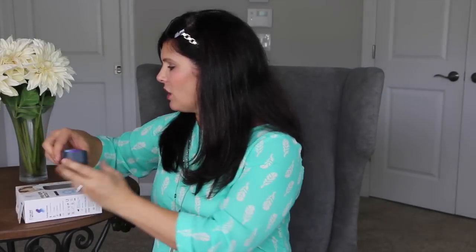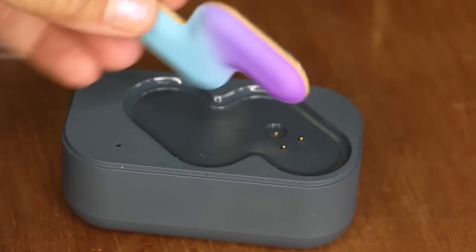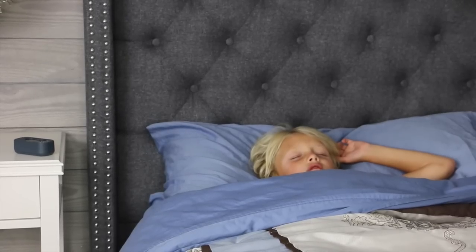It's called Fever Scout, really easy, and it works with the free app. It comes with a charging base — this is how big the thermometer piece is — and the purple part goes underneath the arm. This base has to stay near your child, so you'd set it on a dresser right next to them, while I can be downstairs or anywhere in the house and it will still talk to my cell phone.